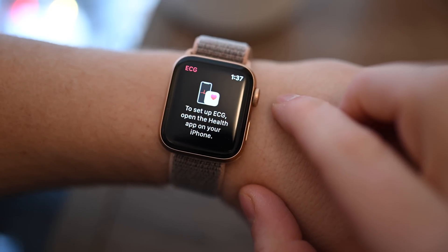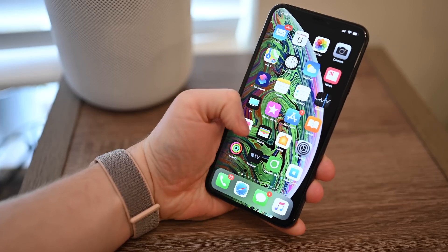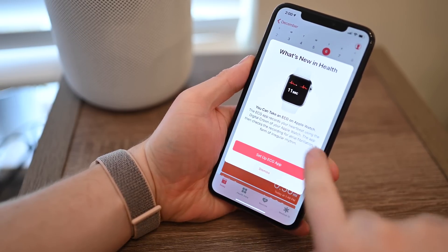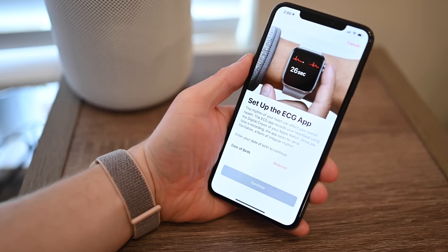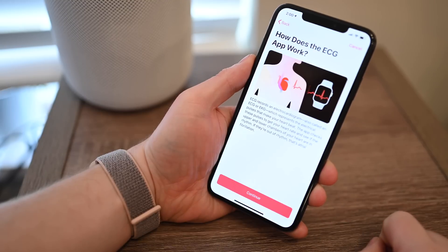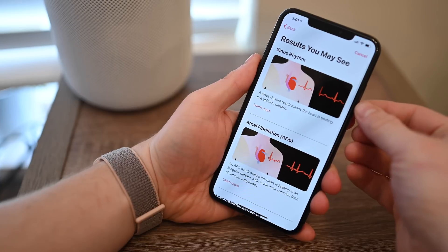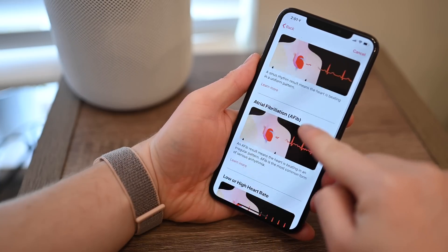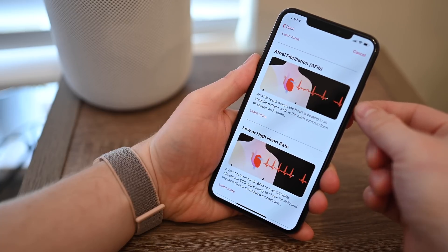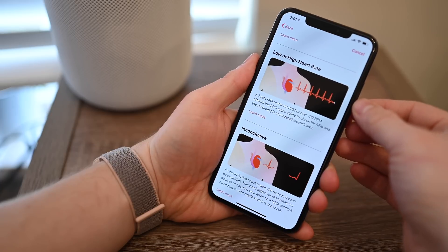Once you install the watchOS 5.1.2 update and launch the app, it will alert you to open the Health app on your iPhone, which needs to have iOS 12.1.1 installed. You will then walk through a few prompts, including entering your birth date and understanding how watchOS and the ECG app works. It also explains some of the results you might see, including AFib, low or high heart rates, or just inconclusive.